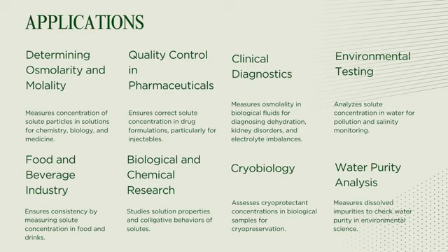It is used to measure the osmolality of biological fluids such as blood, plasma, urine, and serum. This helps in diagnosing conditions like dehydration, kidney function disorders, and electrolyte imbalances. It is used to measure the concentrations of solutes in water samples, such as in monitoring pollution levels or salinity in oceans and lakes. It is also employed in quality control to measure the concentrations of sugars, salts, or other solutes in food products and beverages, ensuring consistency and flavor.